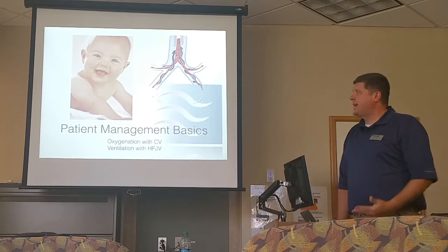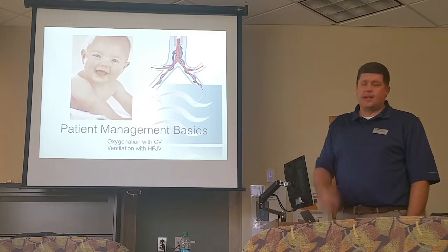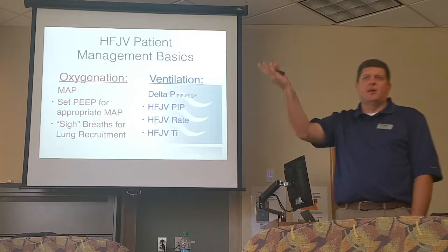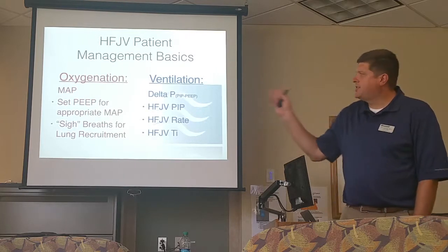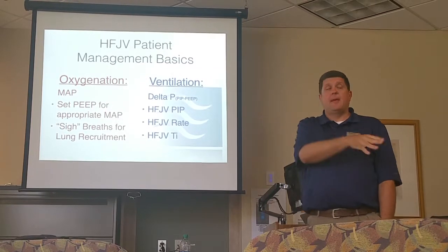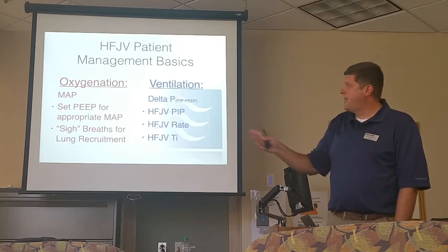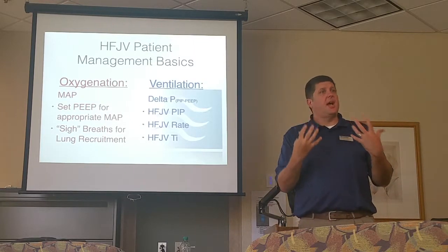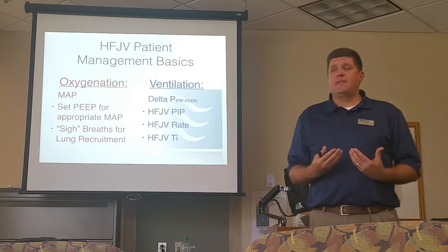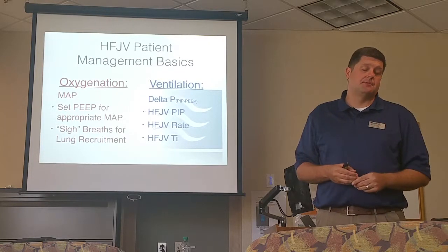All right, so the basics of patient management with the jet, and also the conventional ventilator with the jet, are really no different than any other machine you've ever taken care of, any other ventilator. Oxygenation is always a result of mean airway pressure. PEEP is your primary control for that mean airway pressure, okay? But with using a conventional ventilator with the jet, we have the ability to deliver these sigh breaths for lung recruitment. And they are incredibly efficient and effective towards getting our lung volume back once we have atelectasis.